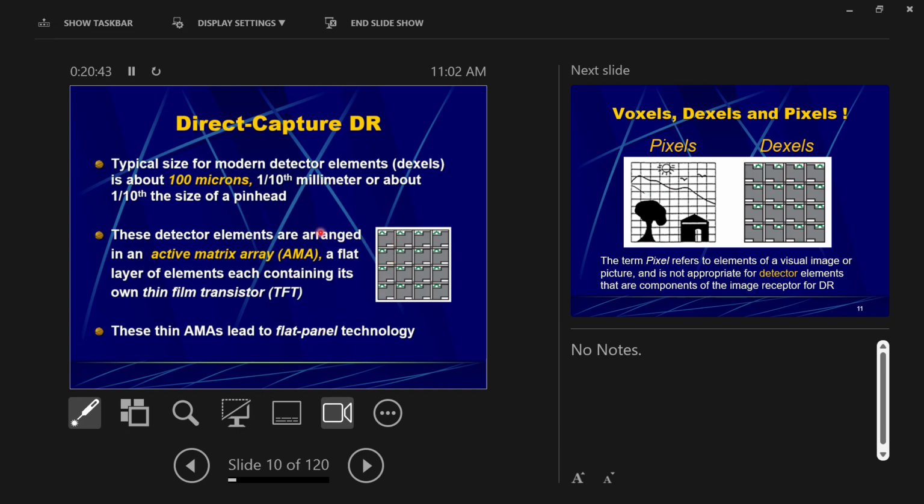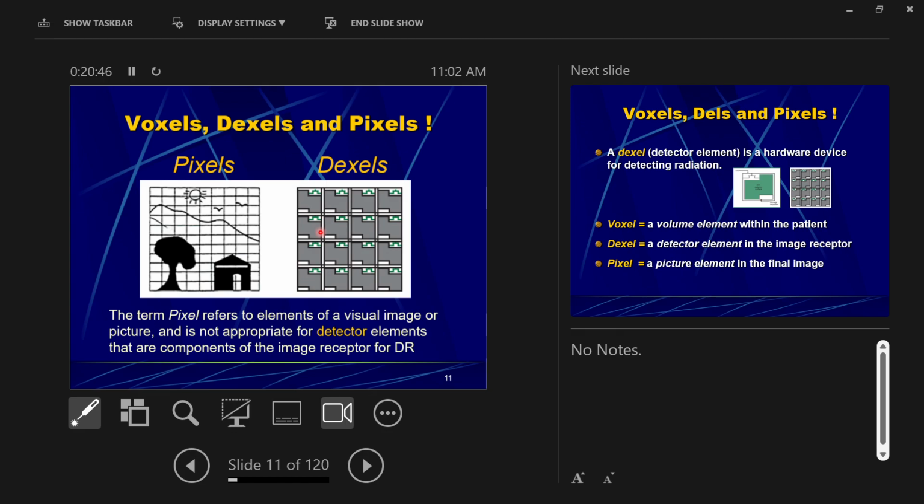Okay, so let's compare pixels to DEXels. So if you remember, a pixel is a part of your screen, right? The pixels are part of the hardware for your TV screens. This is how your images are displayed, right? You can't see it, but the screen that you're looking at, your computers, your phones, this TV, my computer, are a matrix of tiny squares, right?